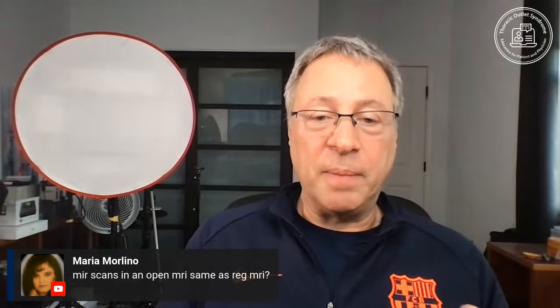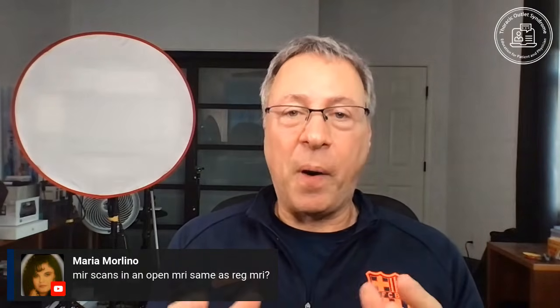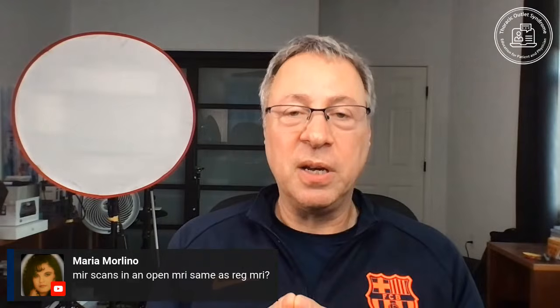So in general, I recommend most patients go with a high field MRI or a standard MRI, whether it's 1.5 Tesla or 3 Tesla. A side question is I have patients ask me whether our partners use 3 Tesla magnets because they've heard these have a lot of advantages.